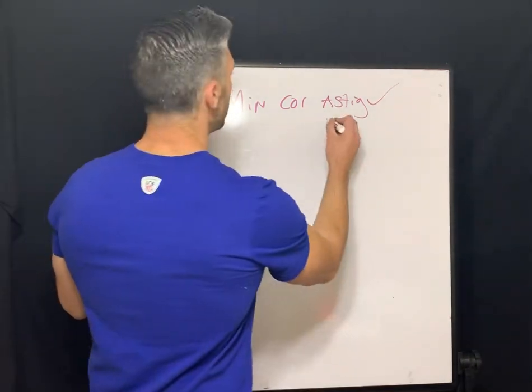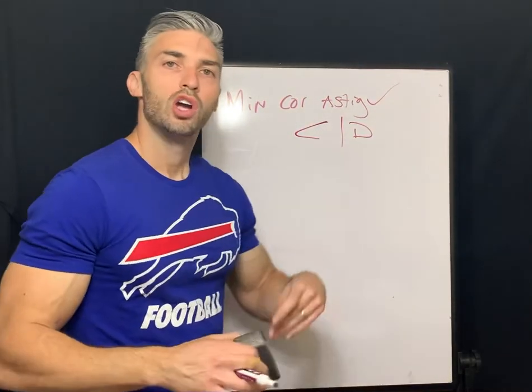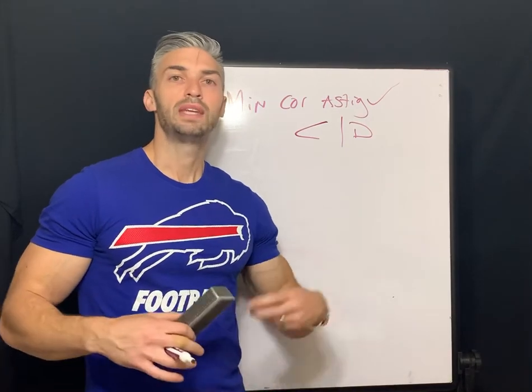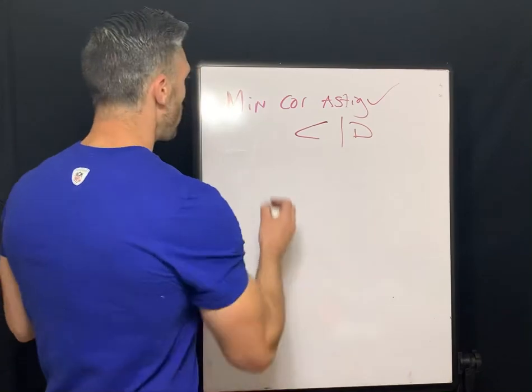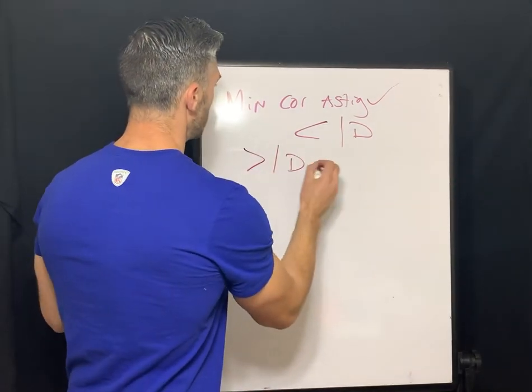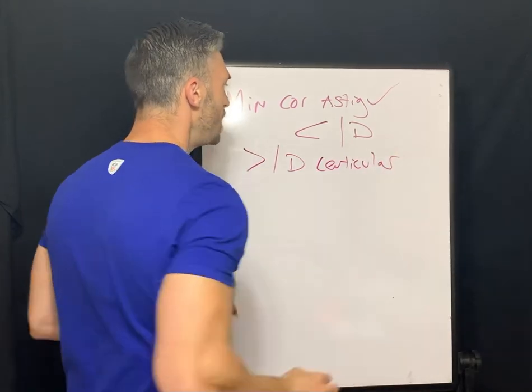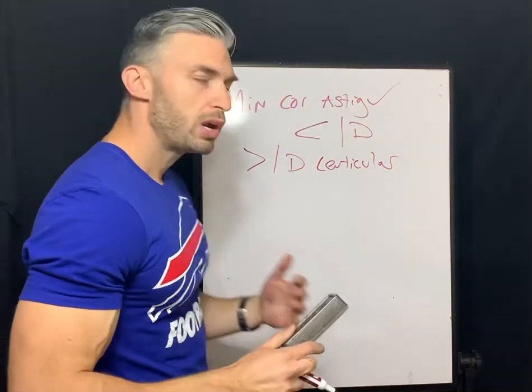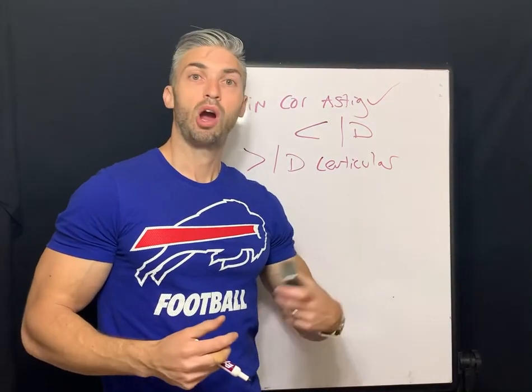It'll be like less than 1 diopter. You also want to have greater than a diopter of residual astigmatism or lenticular astigmatism to warrant using the lens, right? So we want over 1 diopter of, let's just say, lenticular. I'm saying lenticular because we know that astigmatism primarily will come from the cornea, which is the primary lens of the eye.